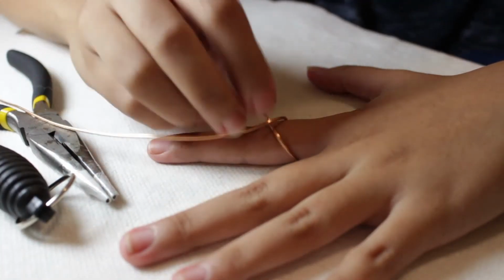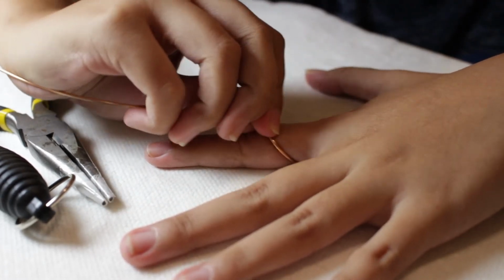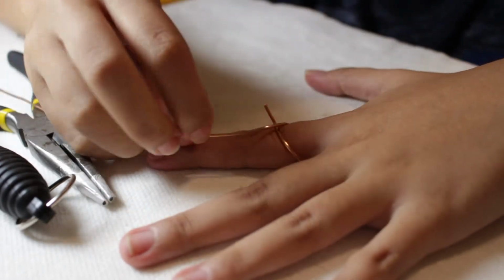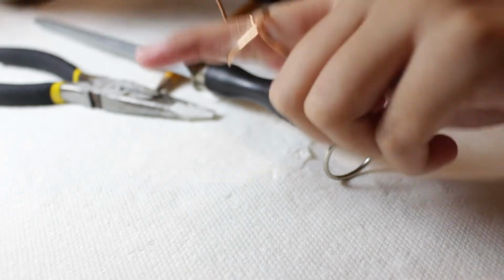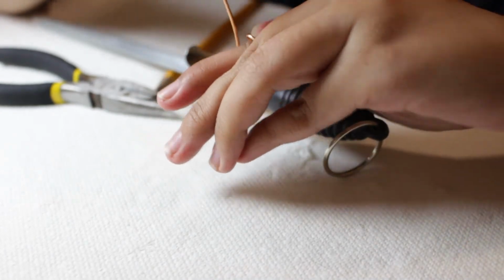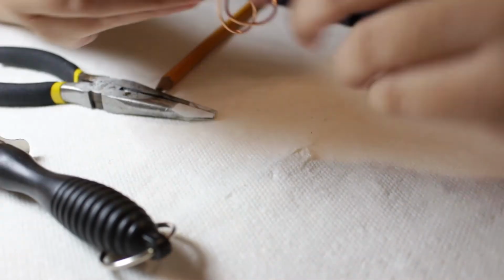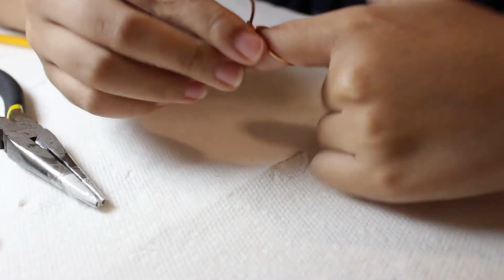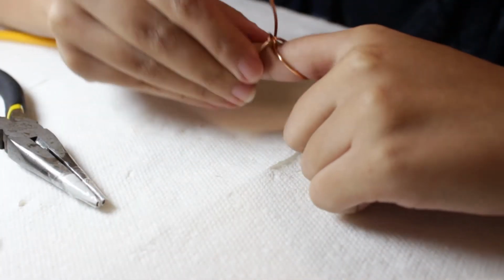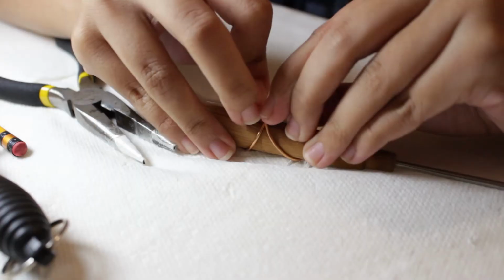Next, I will wrap the wire around the distal belly of the joint and then loop it back up to the starting point. As you can see, I'm using many different types of cylinders just so that I could mimic the shape of my finger. Once I have reached the starting point again, I will wrap it the same way that I did the first time, just so that I could give extra stability to the ring. So it is like mimicking a figure of 8.